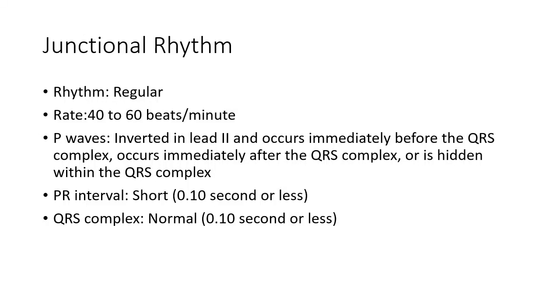Blake. Oh, I just said depends on if the patient's symptomatic. Yeah. Always treat your patient, not your monitor. Bella. Awesome. Okay. All right, guys. That's your review. Now, we've covered the different words that you need to know on your study guide. But again, 75% of your final exam will be rhythm strips or definitions just like this.